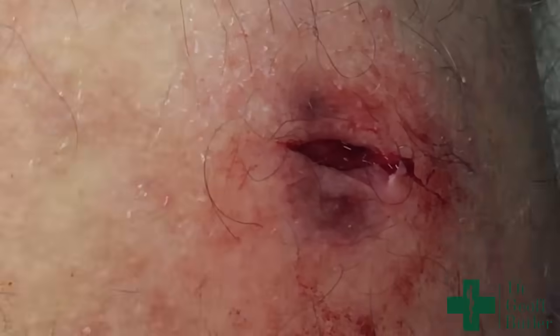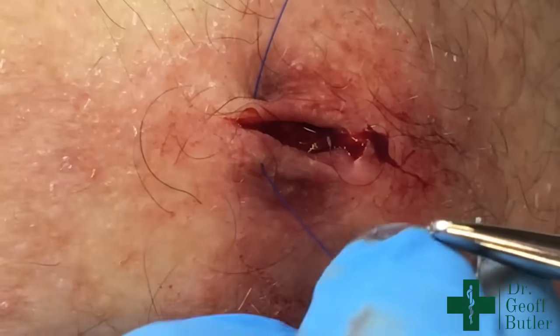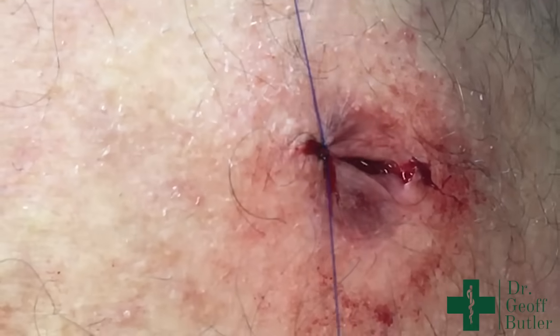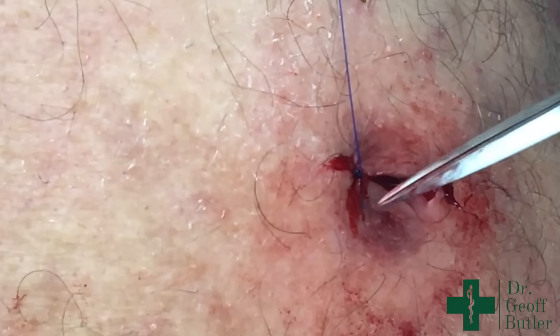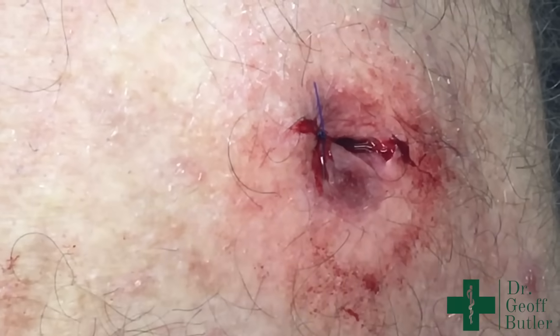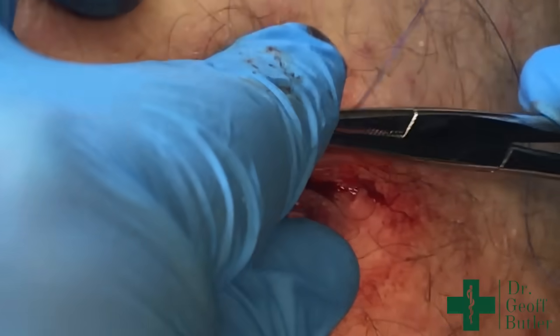Now I can just use 4-O proline, which is a non-absorbable suture type. In cases like this, just because I do a basic linear incision, I'll still sometimes put in dermal sutures — if it's in an area where there's going to be a lot of pressure, like bending at a joint space, you can always put that in. Someone watching might argue, why wouldn't you always put them in, because they do add strength — and there is that argument. But you also have to keep in mind that the body can react to things unusually, and in general if I don't have to add things, I won't.